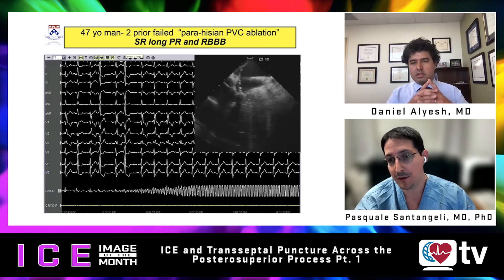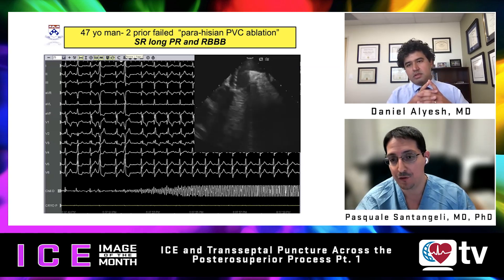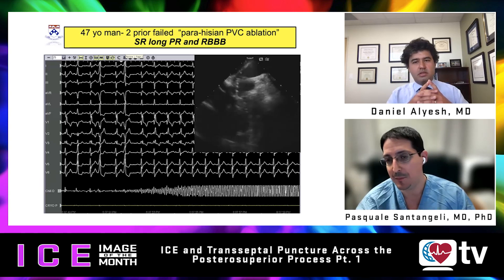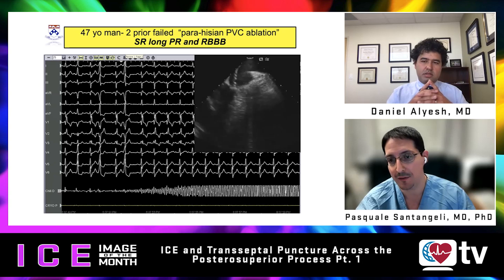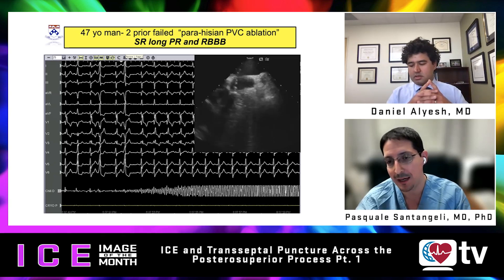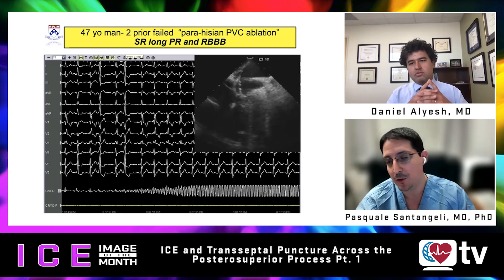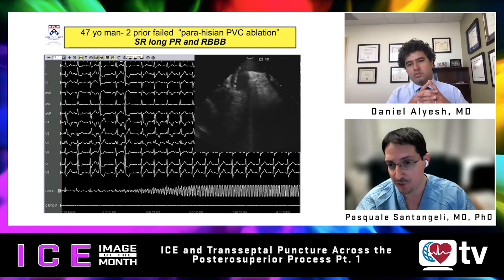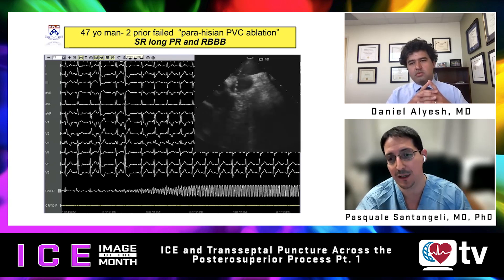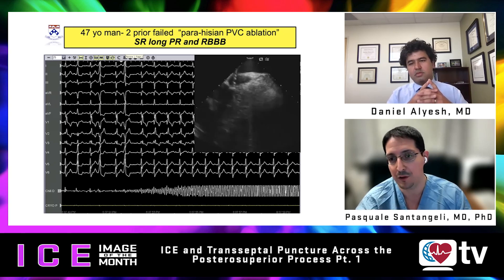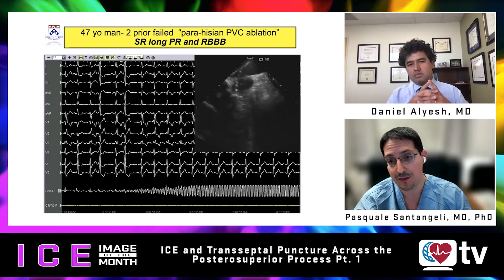When ablating from within the coronary sinus — between the ostium and the middle cardiac vein — you are targeting the epicardial aspect of the mitral annulus, not the PSP. In this ICE view, though the coronary sinus is visible, the catheter is actually slightly outside it, targeting the right atrial aspect of the posterior superior process of the left ventricle.